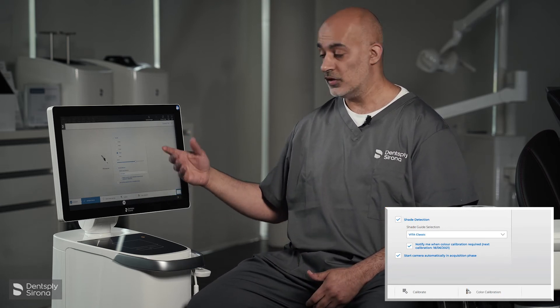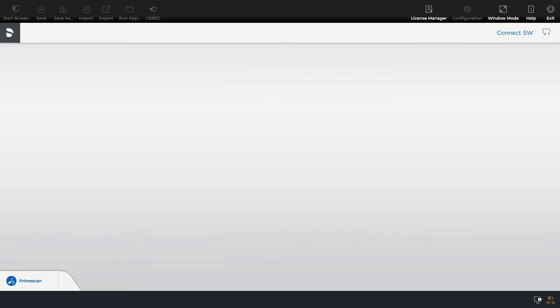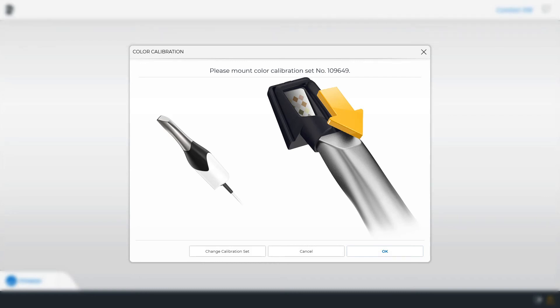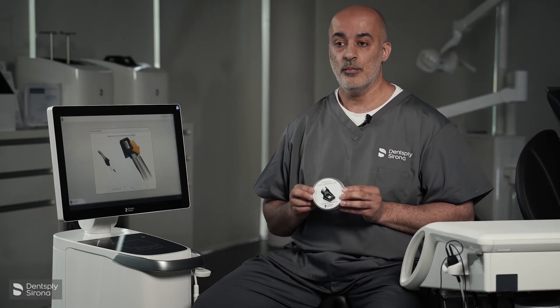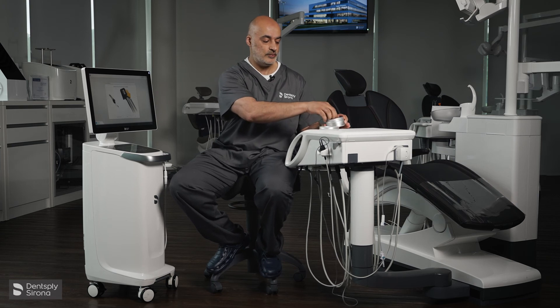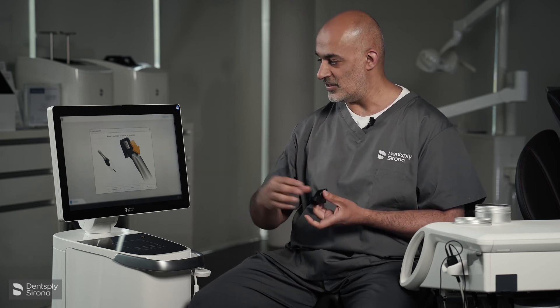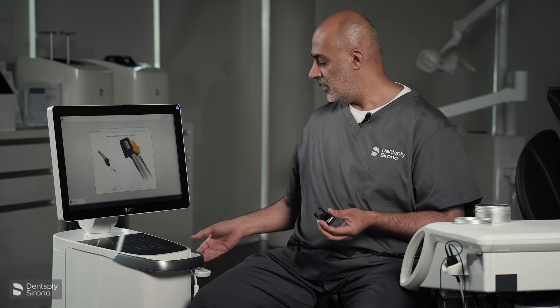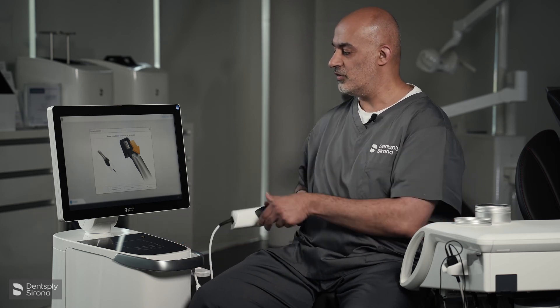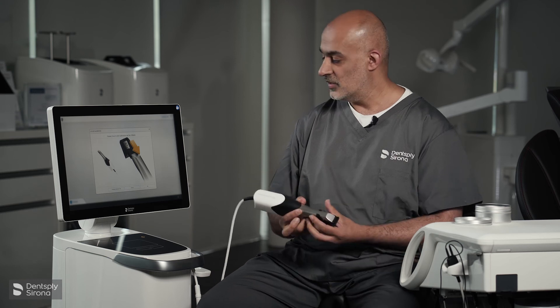You also have the choice of which shade guide you would like to select — you can either use the Vita Classic or the Vita 3D Master. We're going to select colour calibration and select OK. Before we select OK, you will have your Prime Scan calibration box, which is in your onboarding kit. You open it up and take it out. You will notice there are some colour diamonds within this, replicating what you can see on the screen. How we take out the camera: support it correctly and slide the camera on.